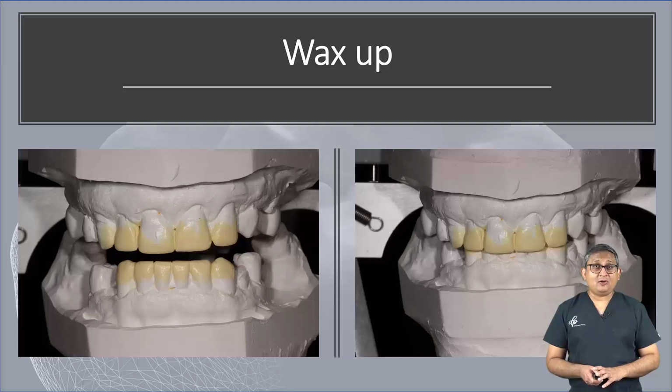I do all my analog wax ups myself because it just gives me an idea as to how much OVD to raise, and the shapes and everything when I'm building. So I like to do my own digital and now the analog wax up as well.